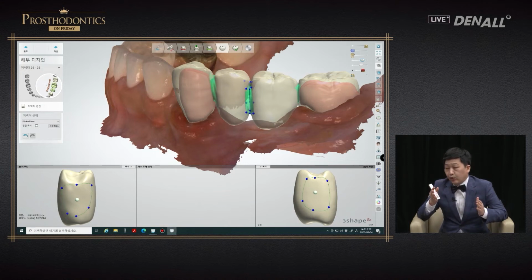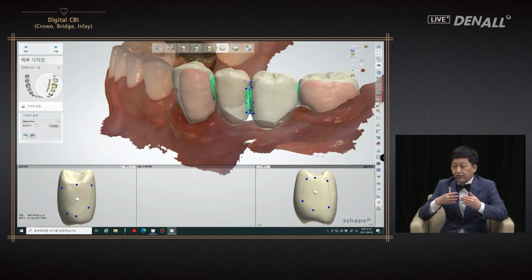When you design joint, the lingual side is not really shown. So in order to supplement the strength, you can make it slightly thicker lingually, but bulkily, if it is protruding too much aesthetically, it can look unnatural. On the buccal side, if possible, you need to make it as if natural teeth are adjoined.